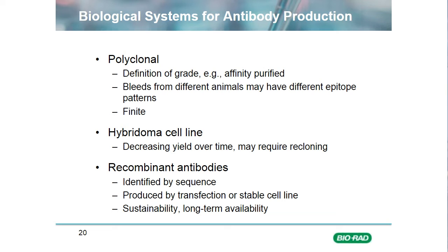And when the supplier does the QC testing on this material, they will probably use the same Fc material that they used as immunogen, and they'll probably adjust the antibody titer so that lot to lot it gives a similar reading. However, the customer probably won't be using this to detect human IgG from serum. They may be using it to detect, for example, a biotherapeutic drug which is a human IgG4. And when they're using different lots of that antisera, they may see very different performance lot to lot because the subpopulation of antibodies in each bleed, which specifically recognizes IgG4, may be different.